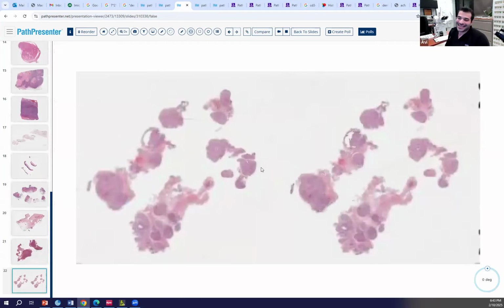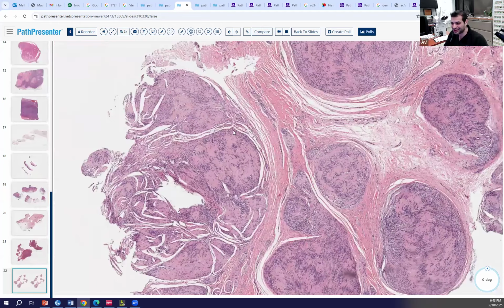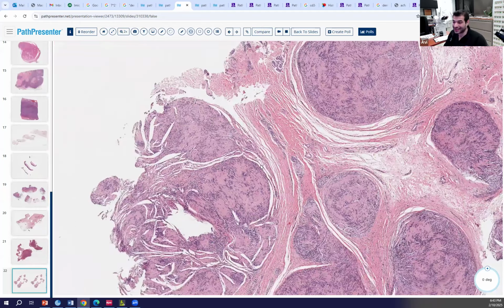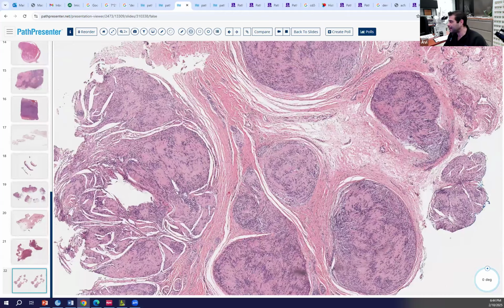Sorry for that reference, but he was very meticulous. Just like superficial multifocal BCC is a misnomer, the multifocality is a misnomer here too. But it looks like it. Definitely looks like it. And it could be helpful because, if it looks like it, you can separate it: plexiform neurofibroma, or in this case, plexiform schwannoma. All right. Good job, guys.